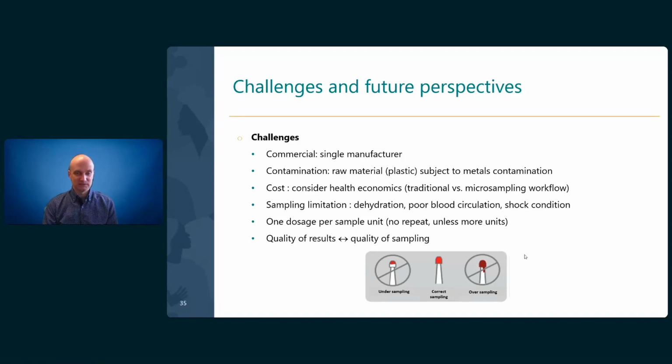Fortunately, this comes in a kit, as I said, 2, 3, or 4 units. So feel free to collect more than 1 unit to make sure you get a chance in case you suspect a contamination or the test just didn't perform well. You will be able to repeat the test if you have a second unit.